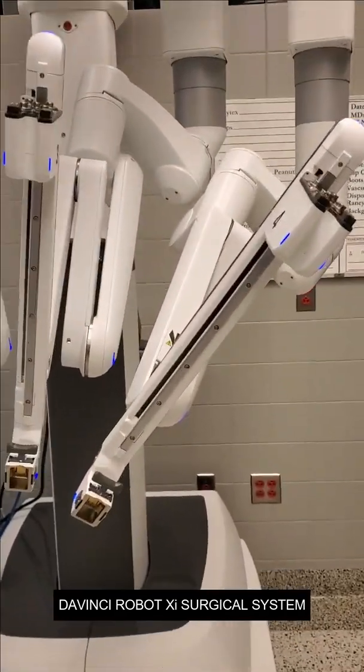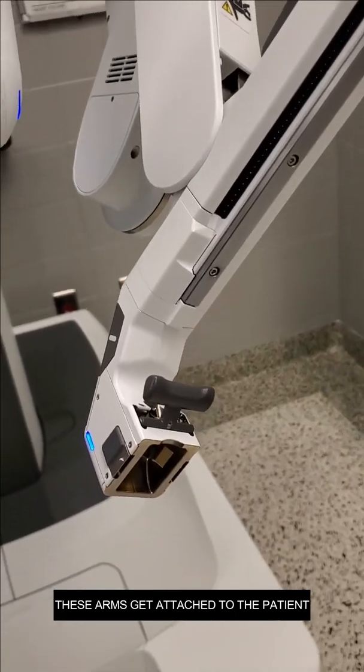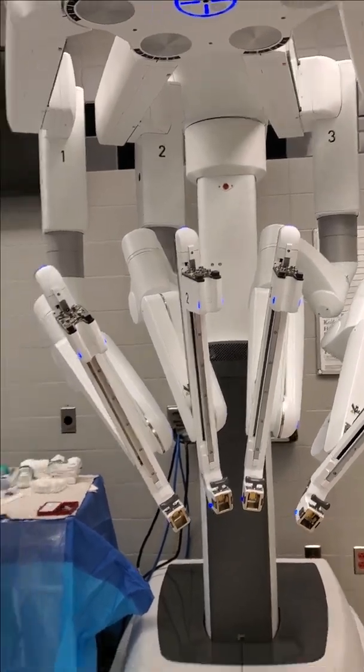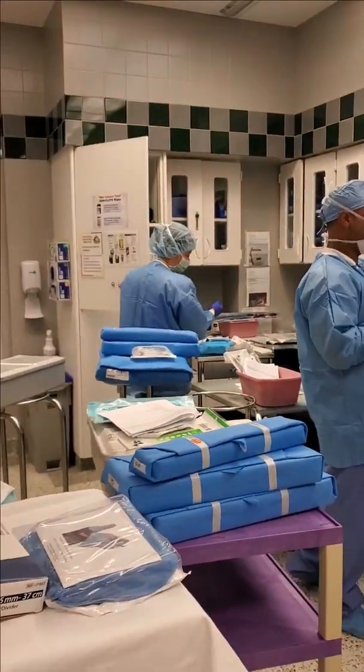And then this is the robot — these arms are what get attached to the patient. This is the latest, greatest robot. These guys are my techs and my circulators. Look at all this equipment.